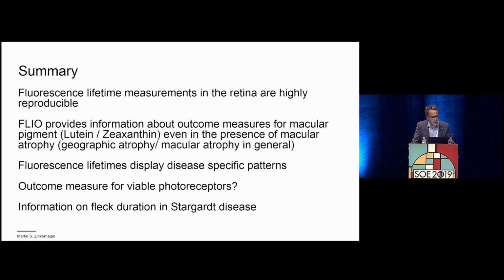Now, to sum it up, fluorescence lifetime imaging is very reproducible. We did, and other groups did, validation studies to look at the reproducibility of this device. And nowadays, there are about 4 or 5 devices in use, and I think there are probably more to come, hopefully.